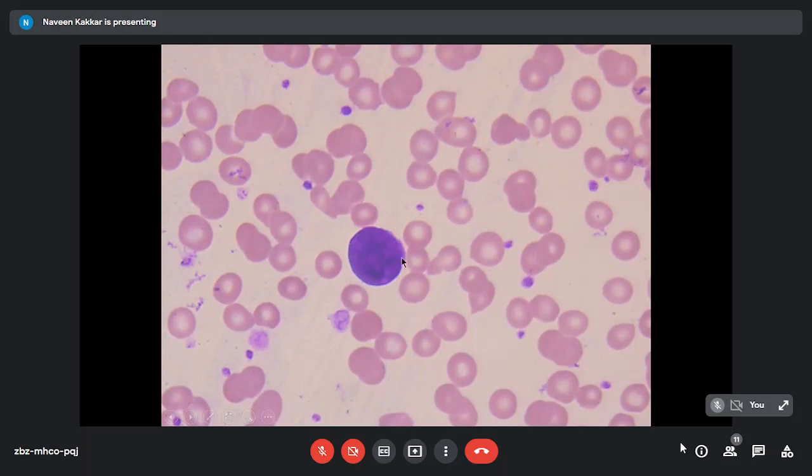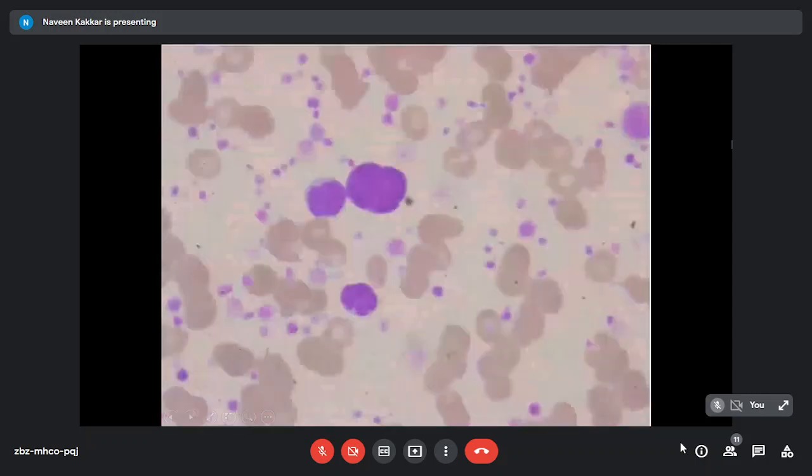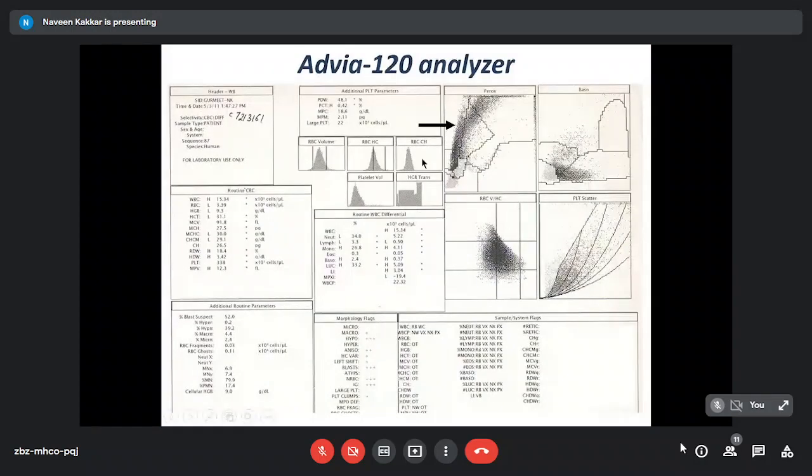If you look at this cell, it's much bigger than any RBC, much bigger than most WBCs, even a monocyte, with very high density, no nucleoli, hardly any cytoplasm. In fact, there's a slight wisp of cytoplasm on this side. In another field, again, these are lymphocytes, with giant platelets here and there. And this is again a huge, dense, big cell with a very dark nucleus and a small bit of cytoplasm here. So these were cells which are not blastic, but were causing a blast flag, or at least a blast indication, in the analyzer.